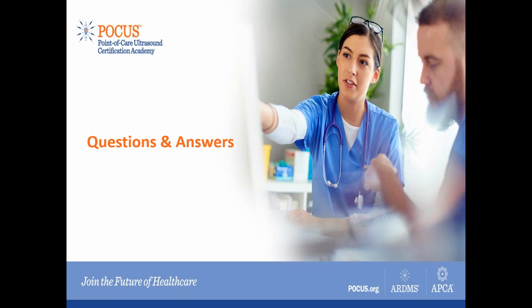It is necessary, and I wish we could do it, but in the point of care setting, the physicians are very, very busy, there is a lot of work to do and a lot of patients to take care of. So in the interest of time, it's a short examination. That's the two-zone compression, but it should be done. So you should be sending the patient for a full study when possible, or when the probability of a deep vein thrombosis is high.